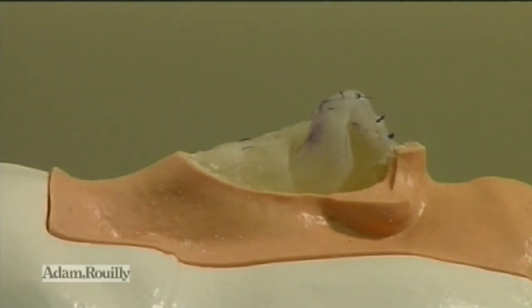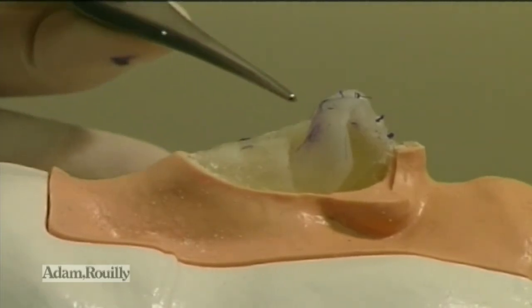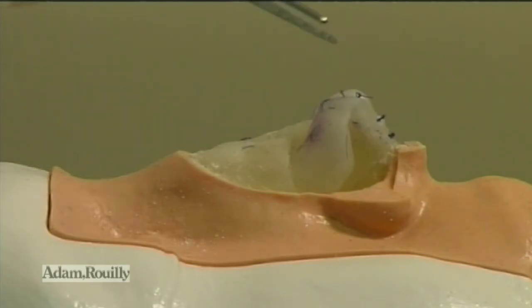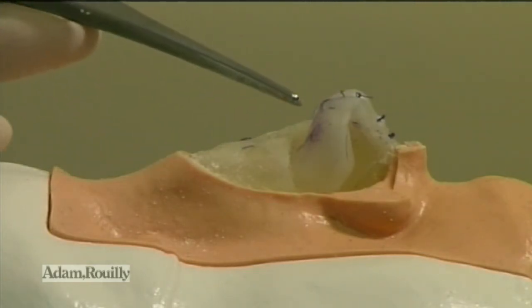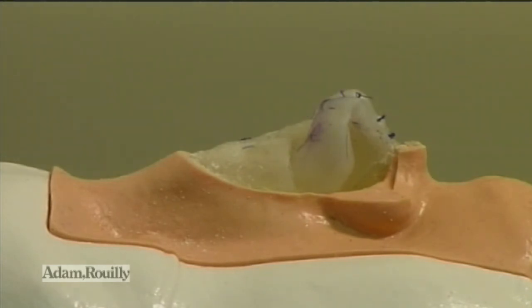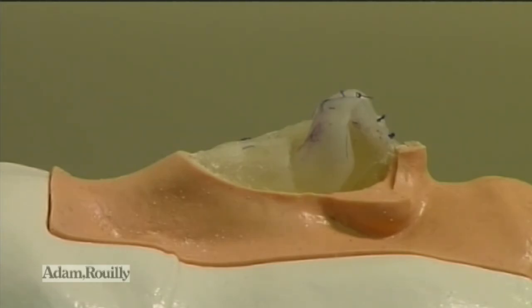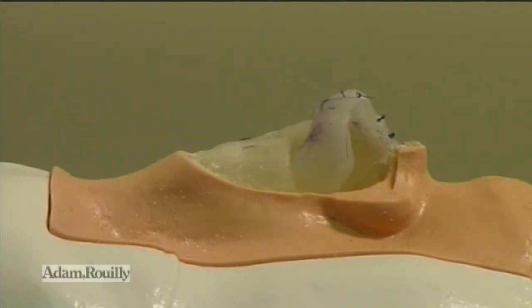It's usually desirable to create a supratip break, particularly in females, and we need to get the tip defining points 5mm to 8mm higher than the septal angle. The thicker the skin, the greater that distance should be. Here it's about 6-7mm, and the skin here is reasonably thick.